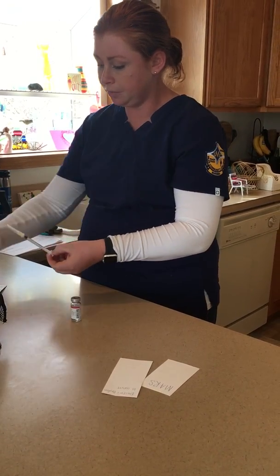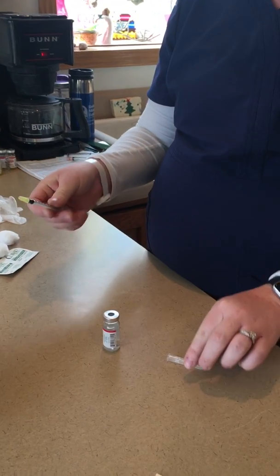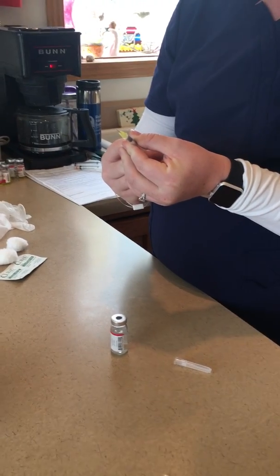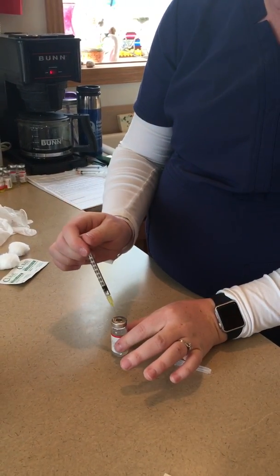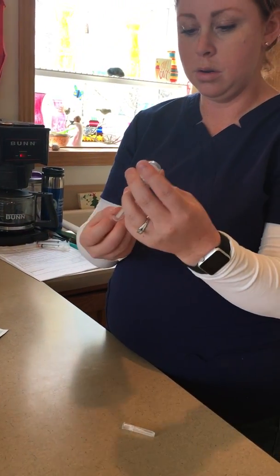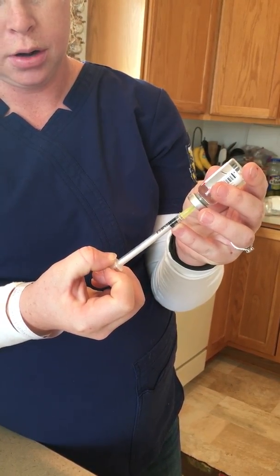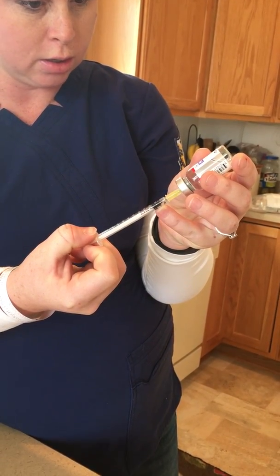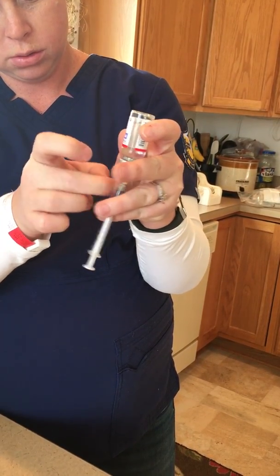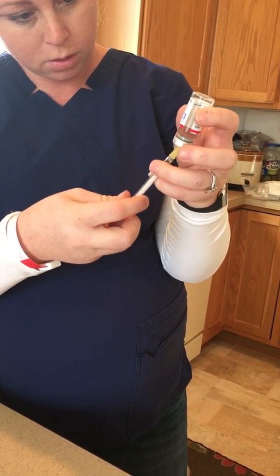open my syringe and uncap my needle without touching anything. I'm going to withdraw 0.1 milliliters of air so that I can inject it into the medication vial. Then I'll withdraw 0.1 milliliters of my medication, making sure that I don't have any air, and I do, so there we go.